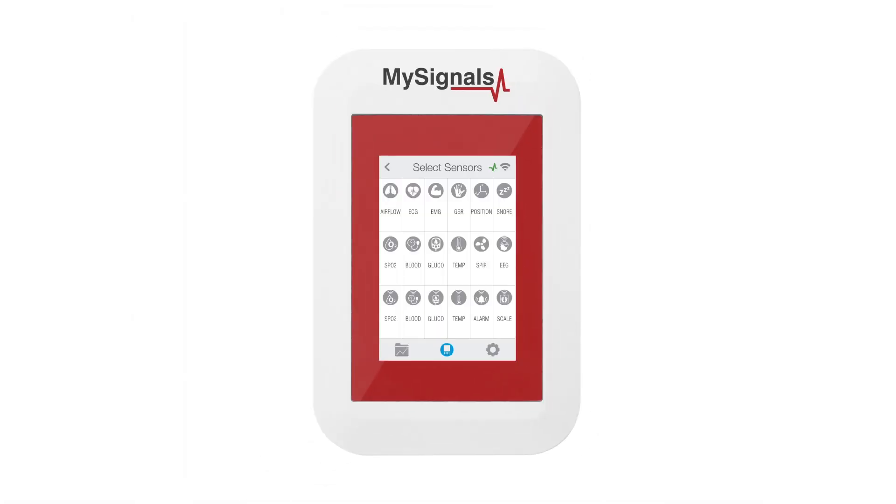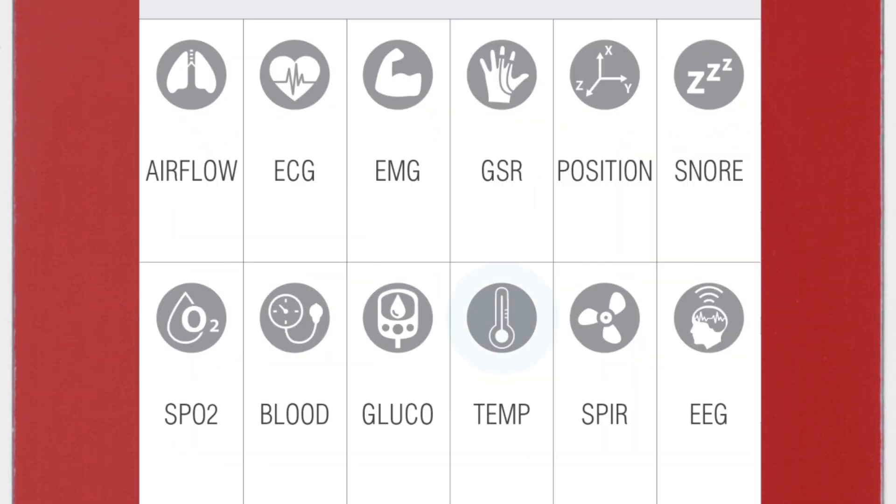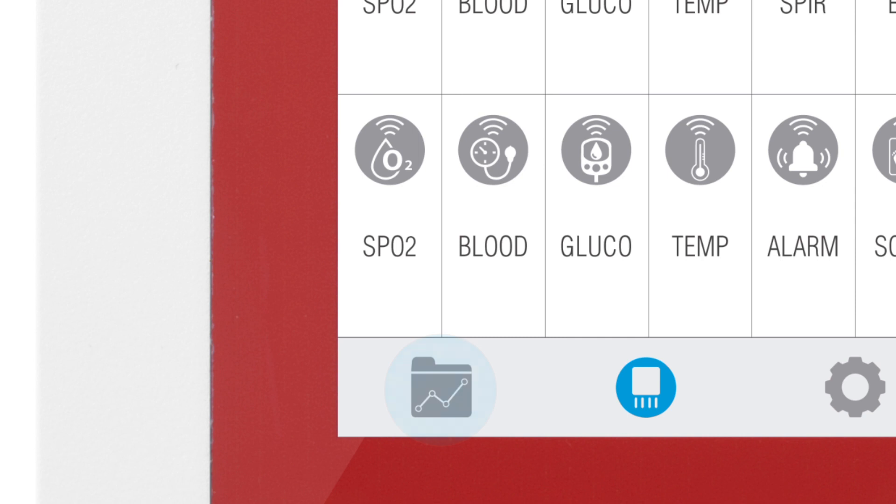In the sensor selection screen, you can see all the sensors available. By selecting the temperature sensor, the icon will turn blue. Then click on the Data button to access the data screen and start visualizing the data.